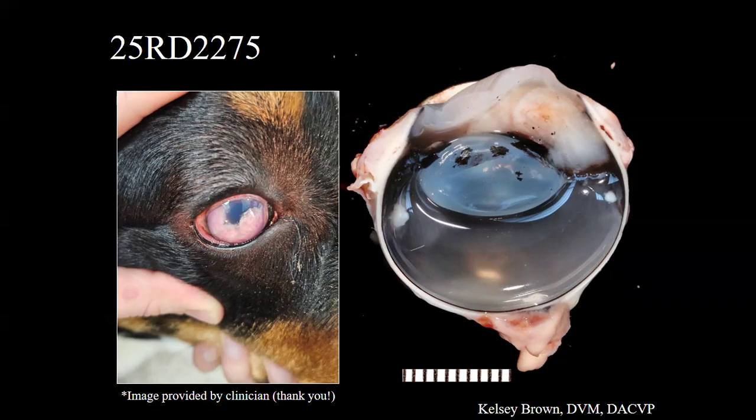All right. I think I have time to get through this case. It's pretty short. So this case is a 2.5-year approximately male castrated Greater Swiss mountain dog. The history we got was for duration of problem was less than a month. Three raised white masses were noted two weeks prior to when this globe was removed. And then at removal, they said more raised pink white lesions were present with progressive inflammation.